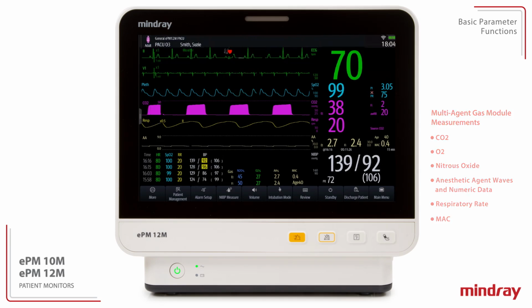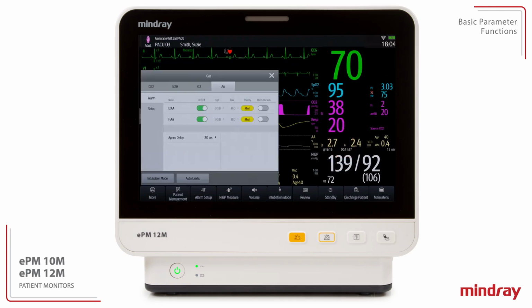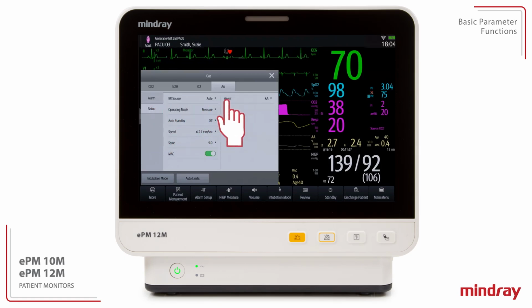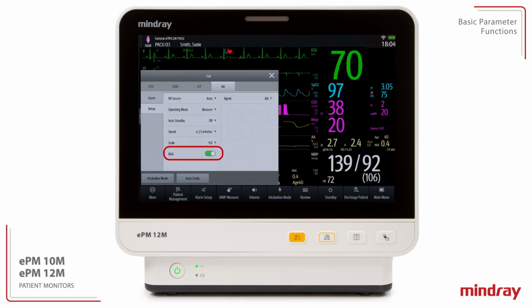Select the anesthetic agent or CO2 waveform or numeric area to enter the gas dialog. Within the dialog, the clinician may review and adjust alarms and select setup functions for anesthetic and respiratory gases, including agent selection. The gas dialog also includes a switch for MAC. Refer to the operator's manual for complete details on advanced procedures and maintenance for the gas module.